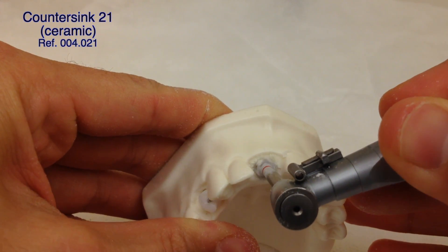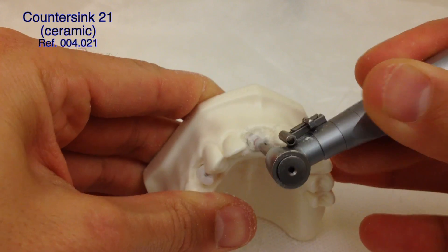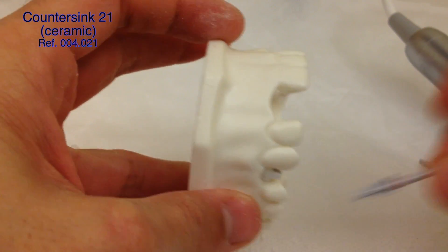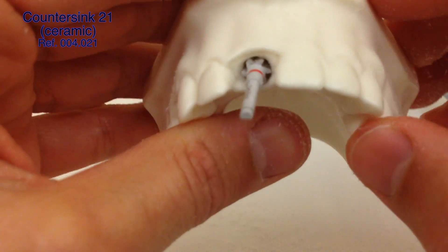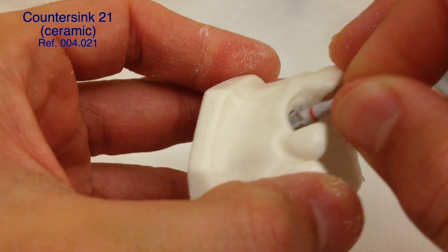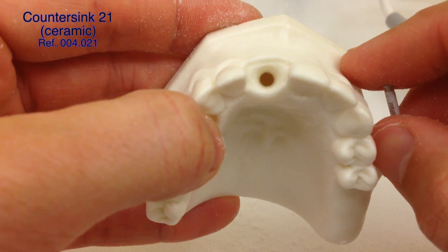We can drill slow or fast but with lots of irrigation. We've reached the final position. It's very good practice to remove the drill from the contra-angle, place it into the socket, and check the position. We can see that the blades of the countersink are about one and a half millimeters above the bone — this is more or less the shape of the bone that we want to have.